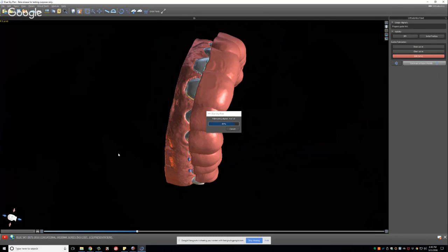Okay. In your opinion, how long do retainers last at the end of treatment? I guess that depends on the kind of patient you have, if they're a bruxer or not. I use Essix C+ material for my final retainers. I know some people that use Endura, or I do have a few patients that are very serious bruxers, and I still get them a Hawley retainer for final retention.